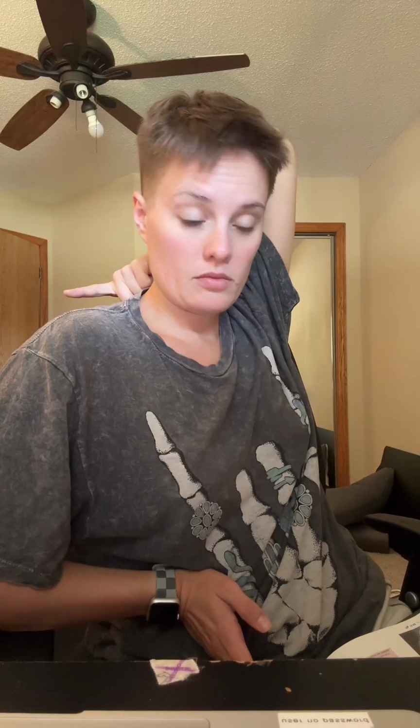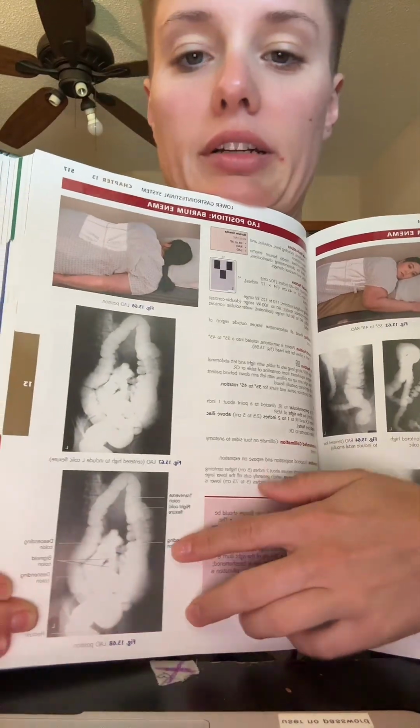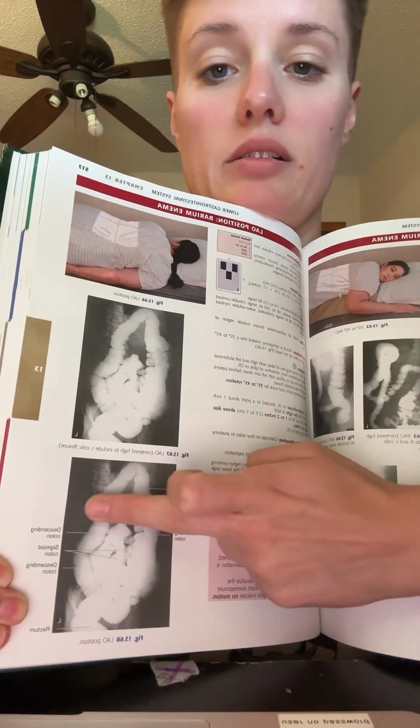So if I see my spinous processes going that way to my left, then that is an LAO. I don't know if that makes sense because I took my meds and I'm not very unhinged right now. Let's pull up a picture. This is the Bontrager book. Copyright Bontrager. Citing my sources here. So this is an LAO, right? Look at how the left wing is up and the spinous processes are pointing to the left.